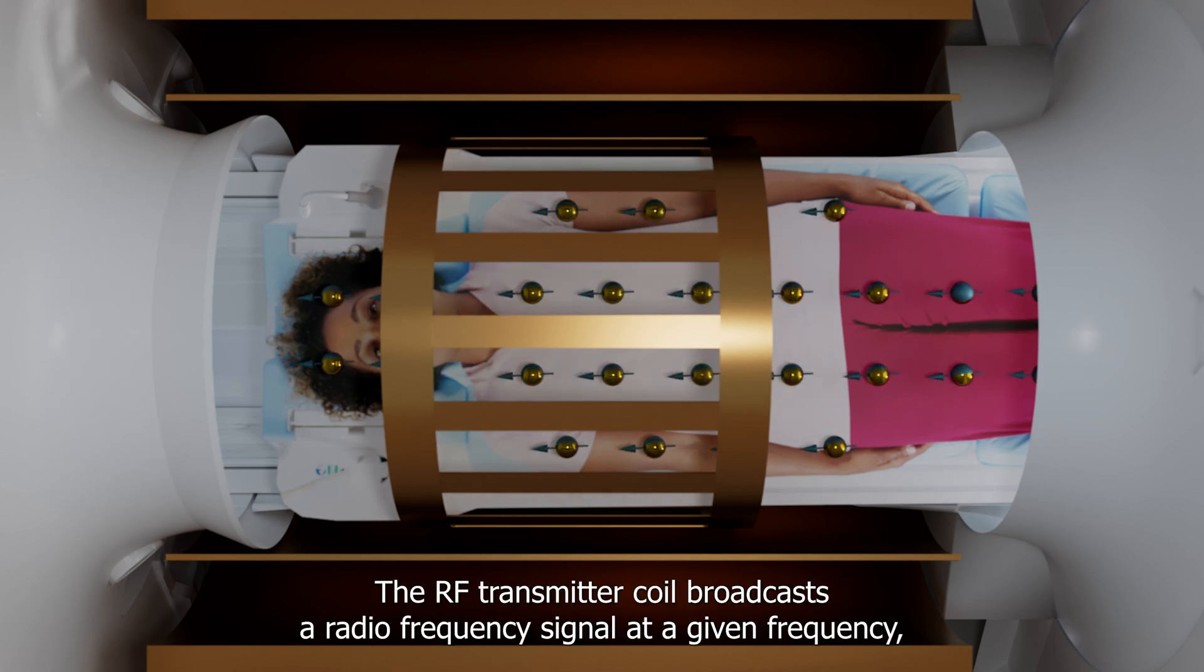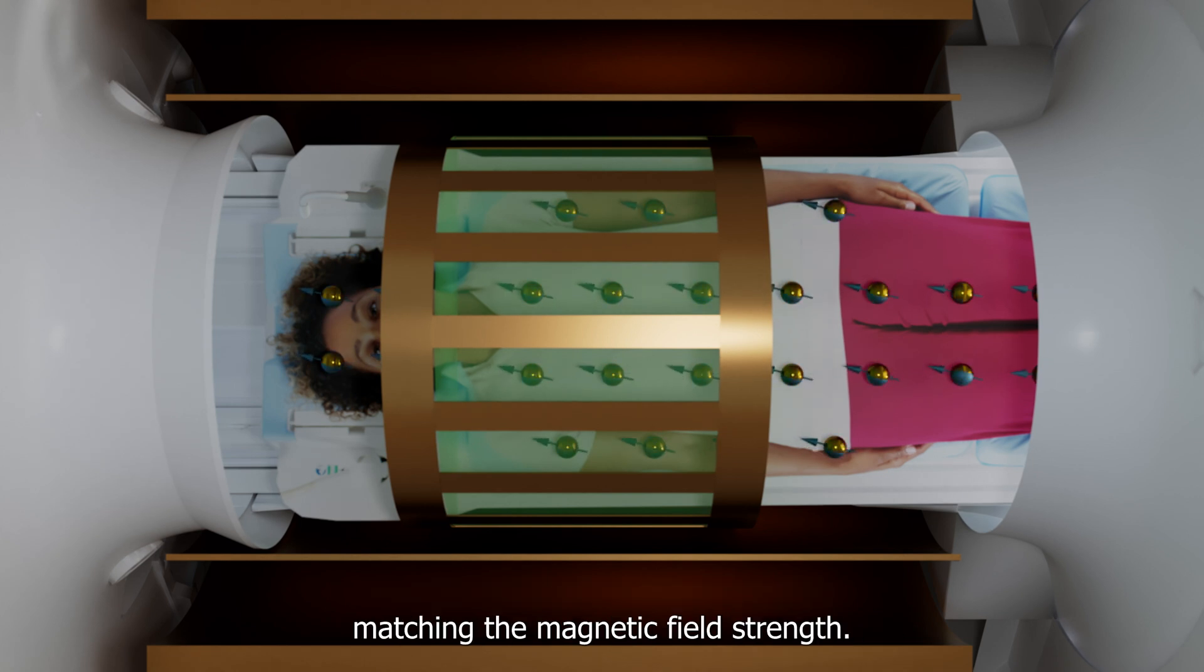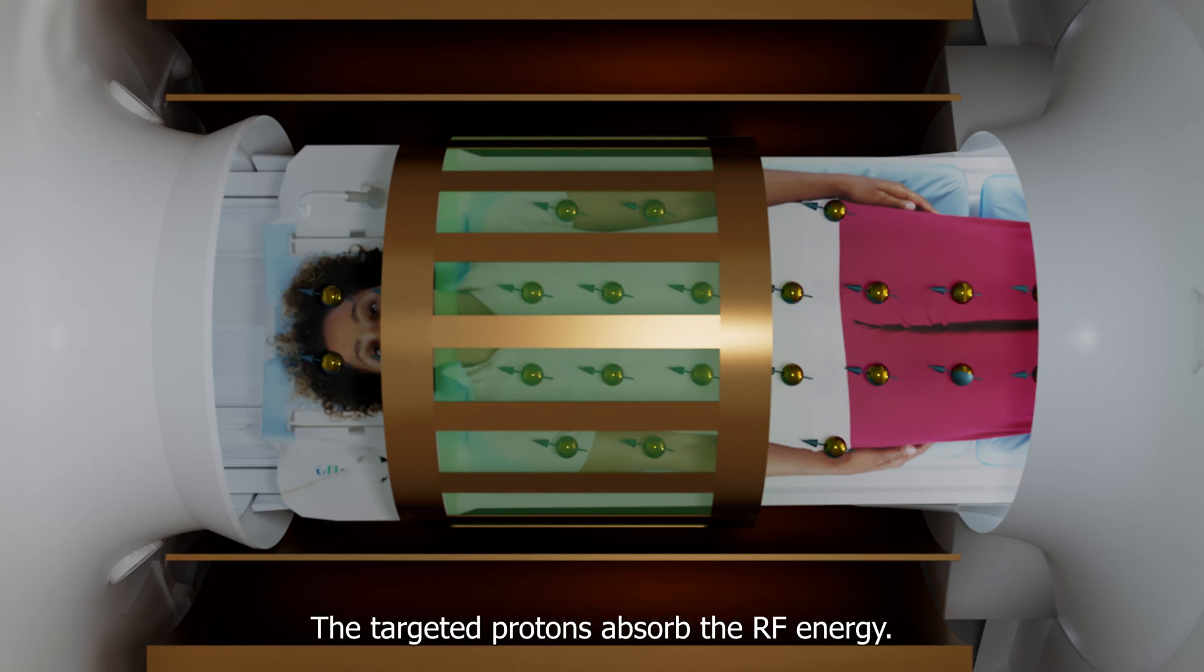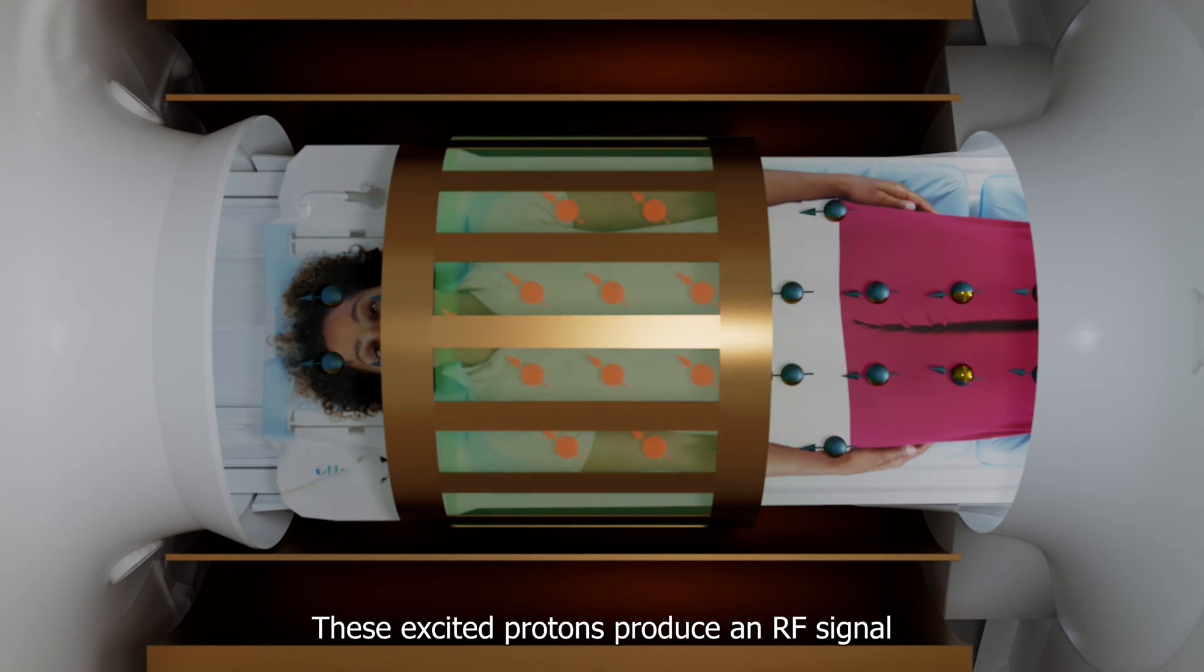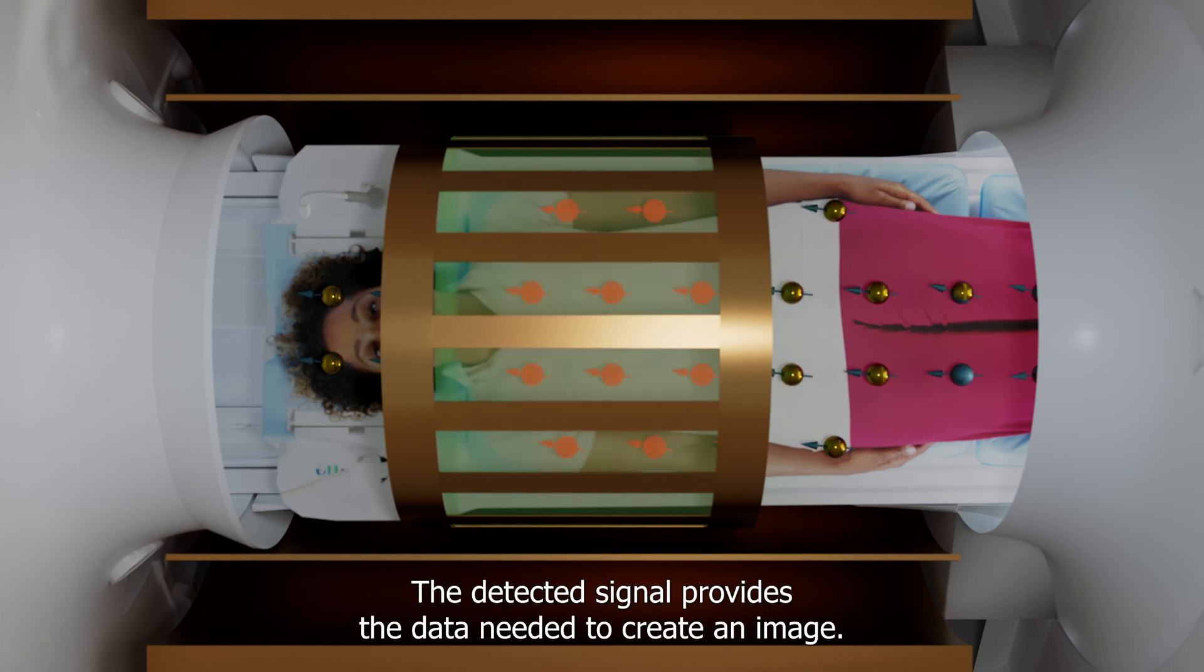The RF transmit coil broadcasts a radio frequency signal at a given frequency, matching the magnetic field strength. This matching frequency is known as the resonant frequency. The targeted protons absorb the RF energy. These excited protons produce an RF signal which is picked up by the RF receive coil. The detected signal provides the data needed to create an image.